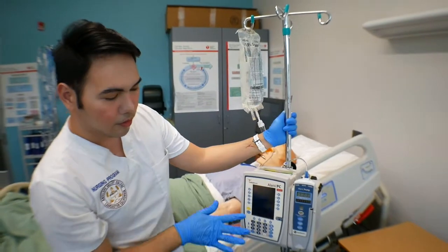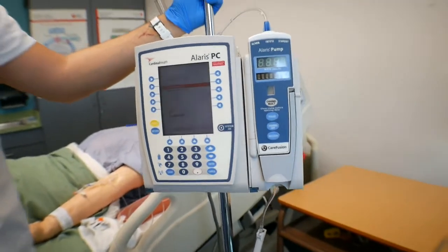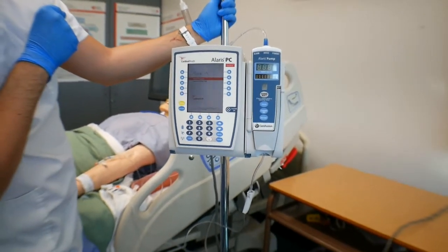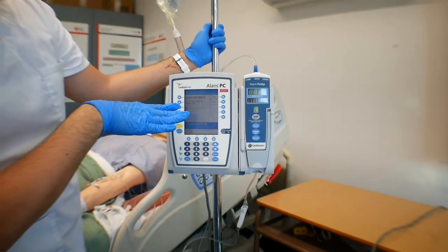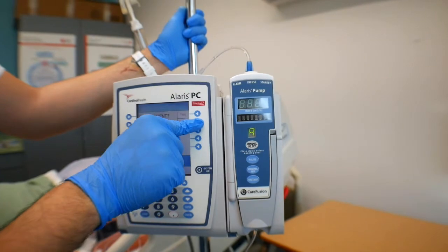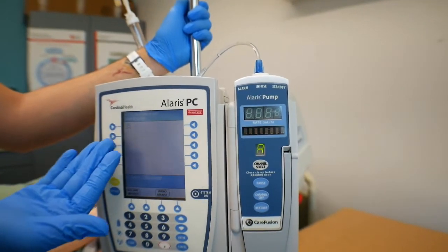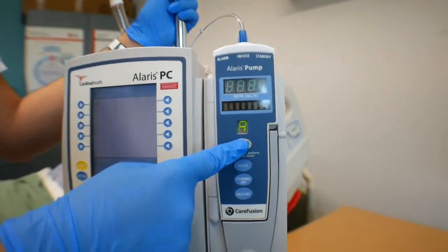We're going to turn it on. So for you to turn it on, just push system on. So it's going to turn on. Okay. So it's asking if we have a new patient. So we'll pretend that Mr. Smith is not a new patient. So we'll just hit no. And we're actually in ICU, so just say yes. So it says here, since we only have one channel, it only shows one channel right here.